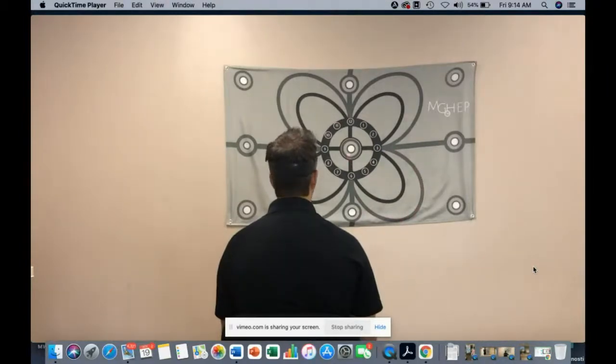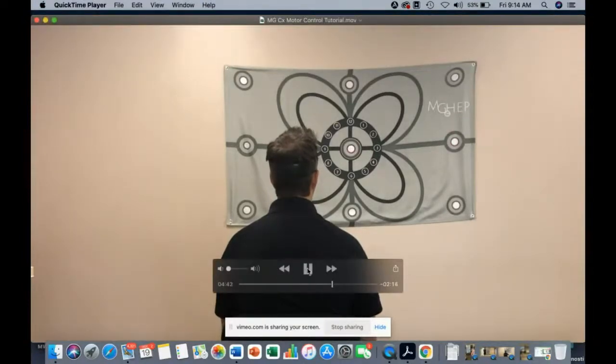So these are things that you could time for a patient, how long it takes them to get around the flag, how many times they go outside of the line dramatically, maybe how many times they stall. And also what area of the flag that happens. If it constantly happens above or below the line, that might suggest some parietal versus temporal issues, and what quadrant to what side could suggest some things there. Okay, these types of flags can also be used for things like saccades.